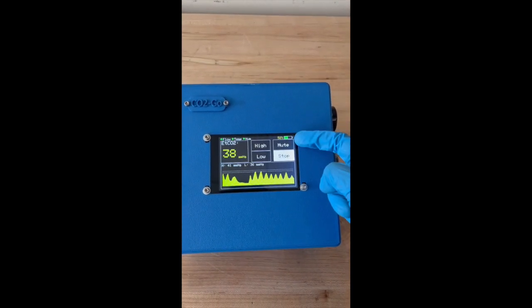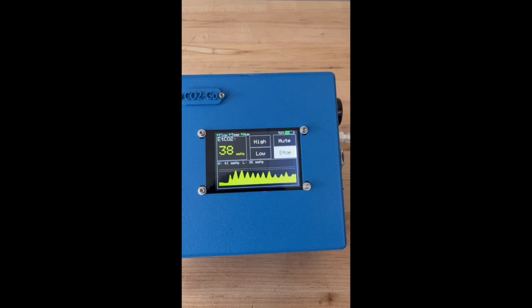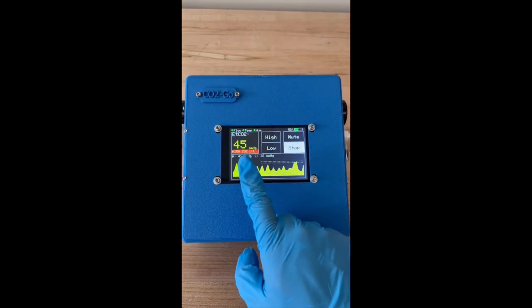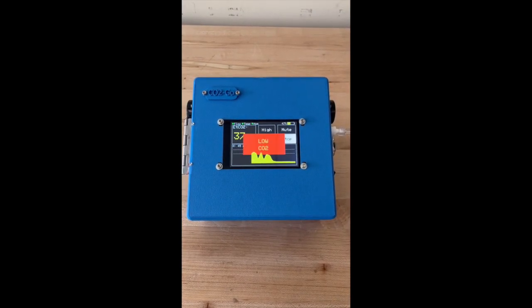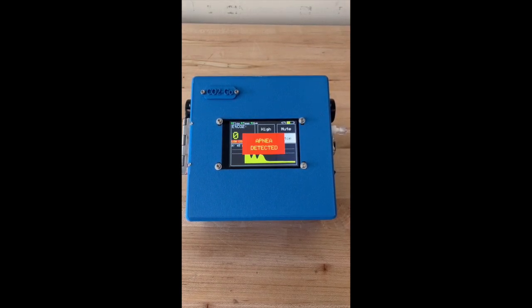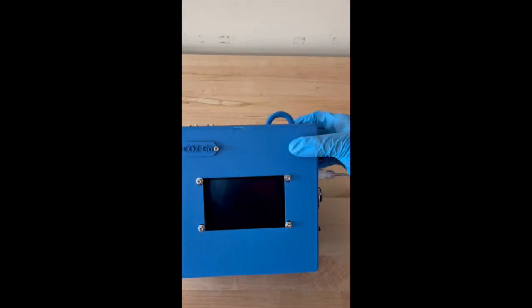On the graphical user interface, we have several other indicators as well, using charging, humidity, temperature, and flow, where it lets you know if there's any issues with any of those three, whether you need to charge it, or if there's condensation issues, temperature issues, or if flow is blocked. The decibel volume was reduced for this video, but these alarms can be muted with the mute button, and they alert healthcare professionals to the breathing levels of the patient.